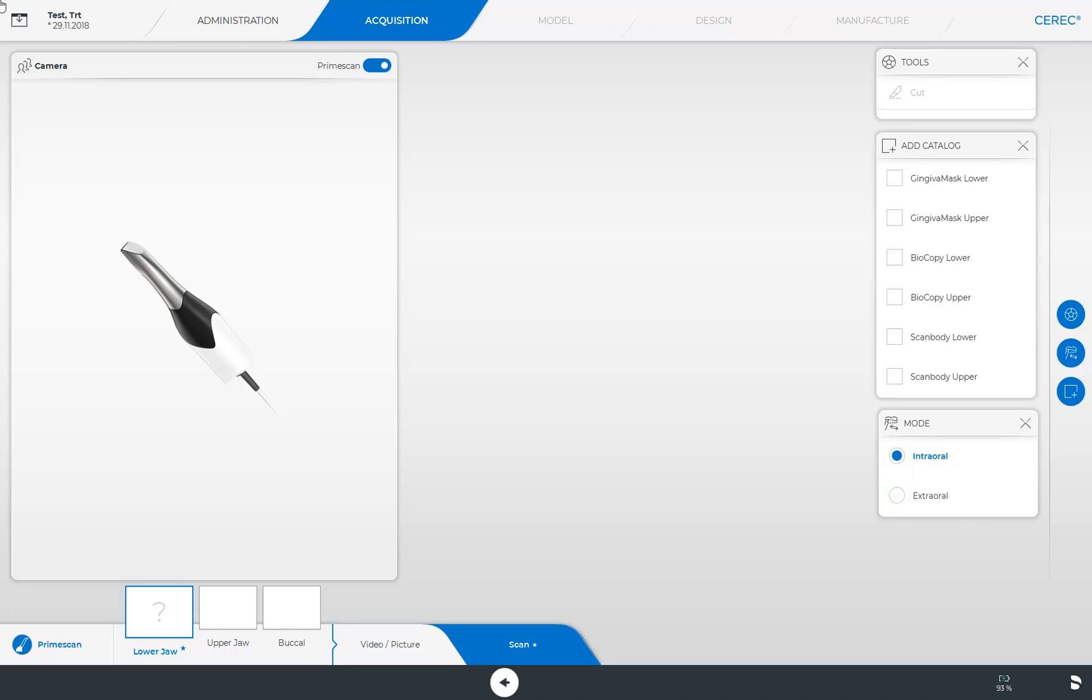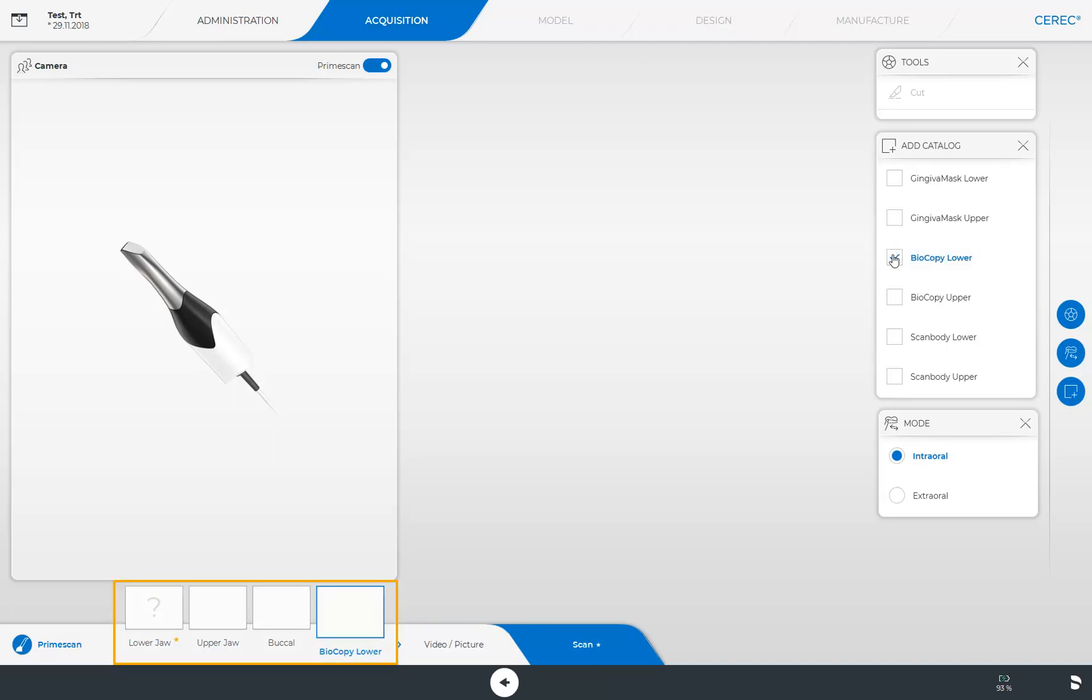Next, we demonstrate how you can add or remove an image catalog. As an example, we click the Biocopy lower catalog. The activated catalog is now displayed next to the default image catalogs. To delete this again, we click once more the option in the window under Add Catalog. Should the catalog already include a scan, the scan must be deleted before the image catalog can be turned off again.